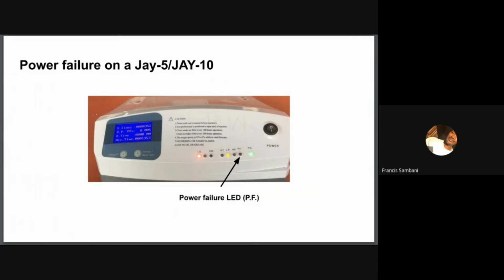It is worth noting that in the Devilbiss 515, the power failure alarm alerts you with a blinking service required light as well as a pressing audible alarm. So that's it on the Devilbiss 515 and the 1025.